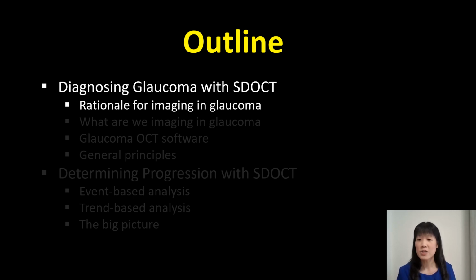So imaging structural changes in glaucoma disease offers us as ophthalmologists an opportunity to not only, 1, diagnose glaucoma earlier, but to 2, initiate treatments earlier to prevent irreversible vision loss. So we as ophthalmologists can make a difference if we really understand imaging.